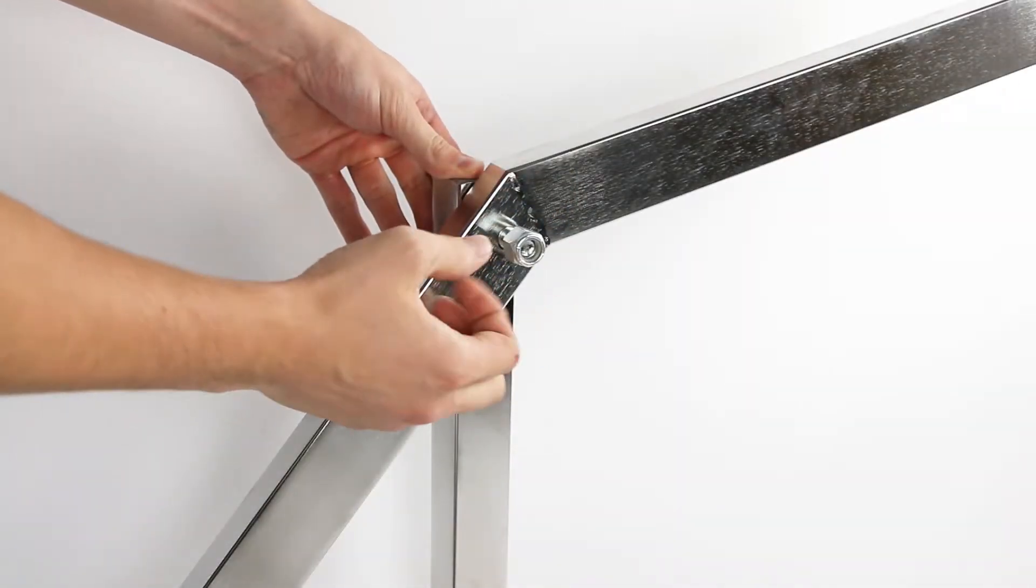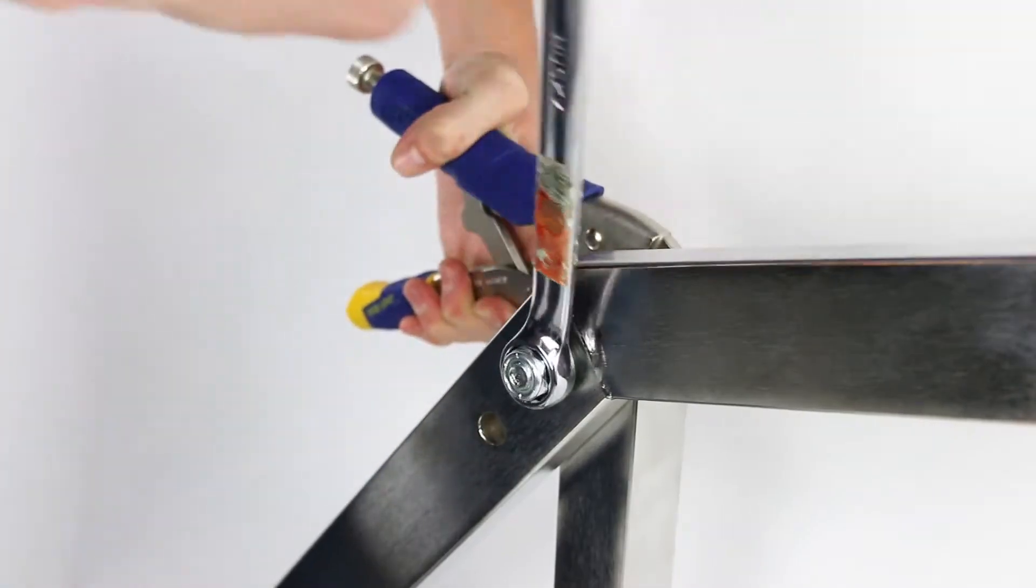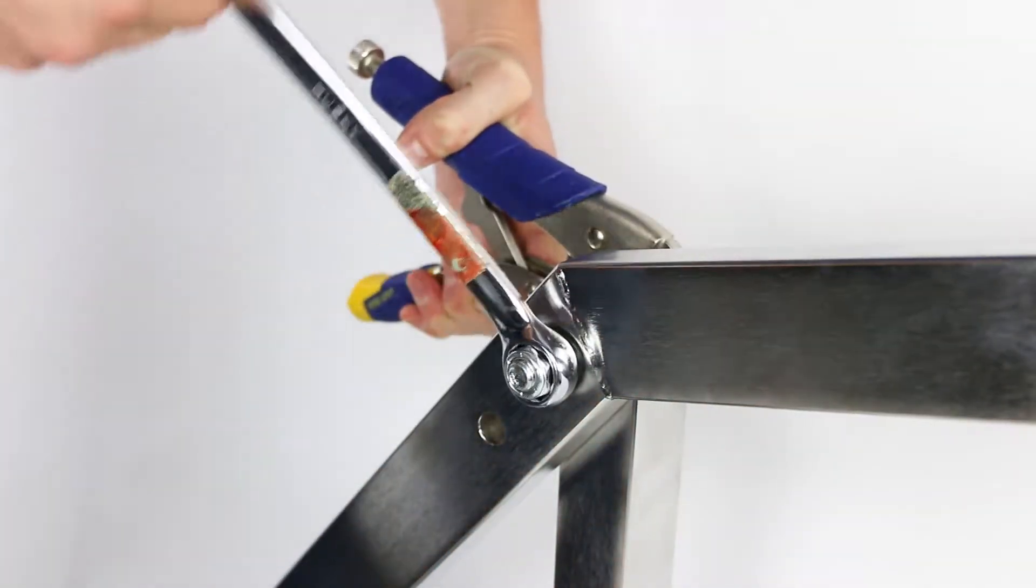Tighten each large nut snugly, but not so tight that the arms bind when pivoting. Lubricate this area with oil or WD-40.